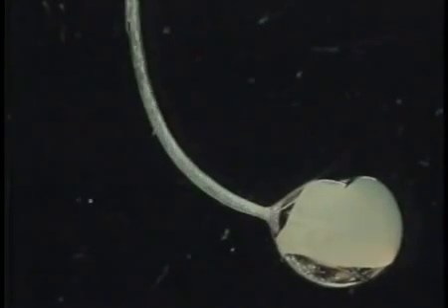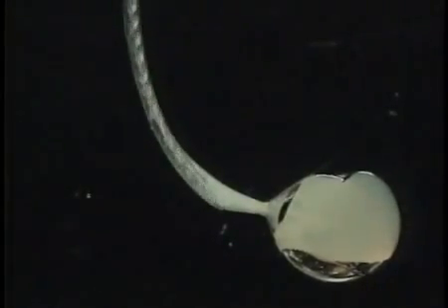Traditionally, clinicians have been trained to work intentionally short of the canal terminus, which promotes a variety of undesirable cleaning and shaping outcomes. The scenario of events usually starts with an apically blocked canal and lost foramen. This commonly contributes to ledge formation. If persistent apical file grinding continues, the blocked and ledged canal eventuates in a perforation.